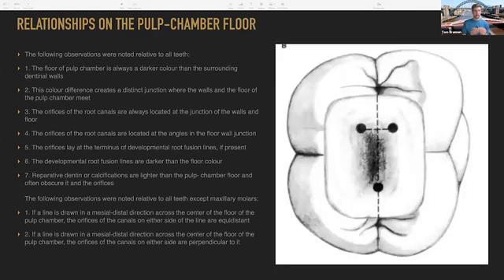And then again, these are some of the, as I mentioned there, where you've got this midline through a lower molar, and as you asked about upper molar, but not lower molar, if you've got a mesial and mesiobuccal and mesiolingual, they'll always be equidistant. So if you can find one, and you know where the midline is, then you know the other one. So say you find the mesiolingual, you know the mesiobuccal is going to be the same distance from that. It's not going to be miles out. In the majority of cases, there's odd anomalies, but this is generally the case.